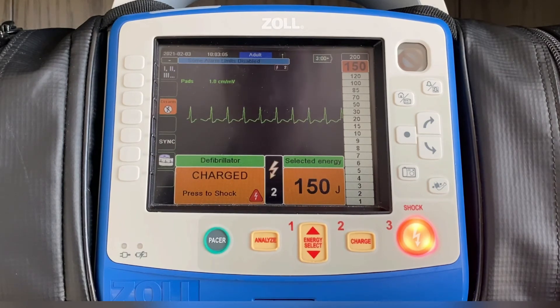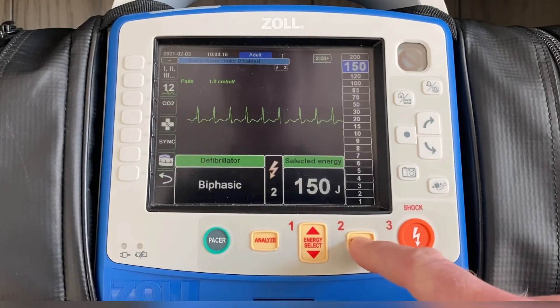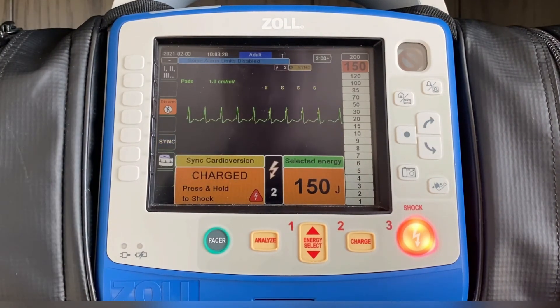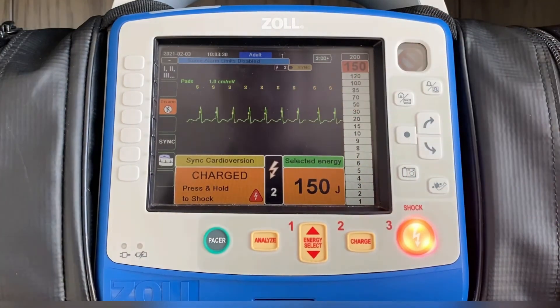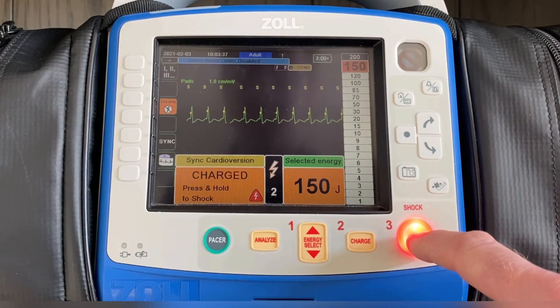You have two different ways to mitigate that problem. One is by hitting the disarm button, which will kick the energy back into the machine and not deliver it to the patient. Or, if the monitor is charged up and you forgot to hit sync, you can still hit the sync button even though it's charged up. You'll get your sync indicator, the S's will come across and march right above the QRS complexes, and then you can safely deliver the energy because it says "sync cardioversion, press and hold to shock."